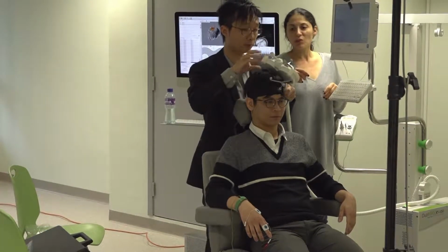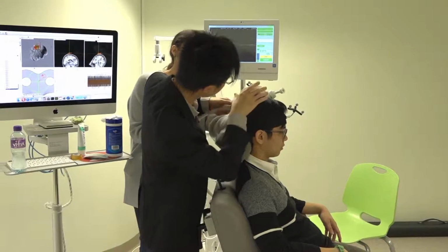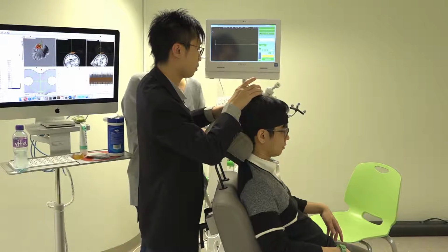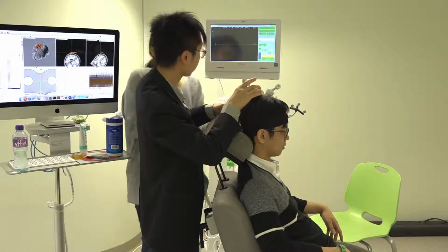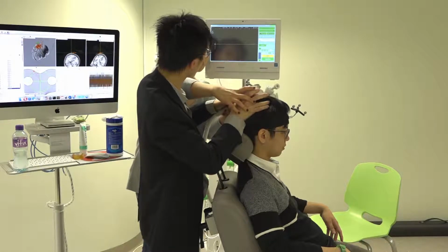Exactly, it should be somewhere there. 45 degrees. 45. According to this, in this quadrant, 45 degrees. Don't be afraid to touch the person, because you want to manipulate the coil and move it. Okay.